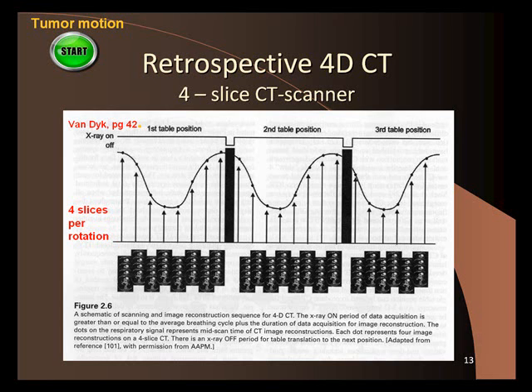So they say, we want to treat the patient right at this breathing cycle only. Not the entire breathing cycle, only this one. And that corresponds to this position, for example, of the tumor. And we're going to base all our treatment planning on this scan. This is an entire CT scan right here of one cycle.